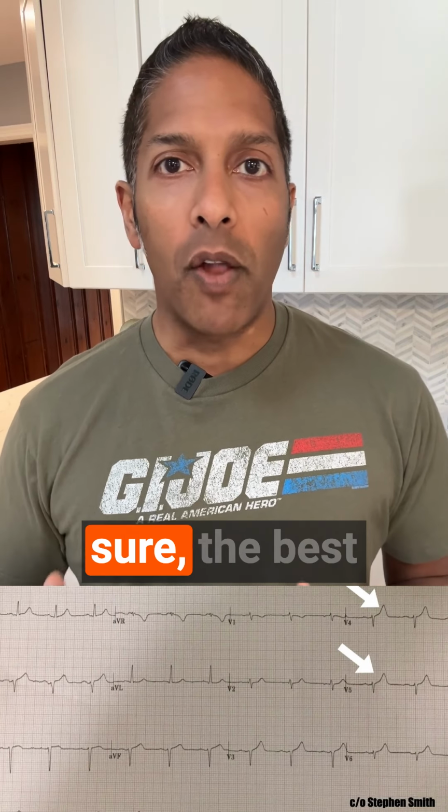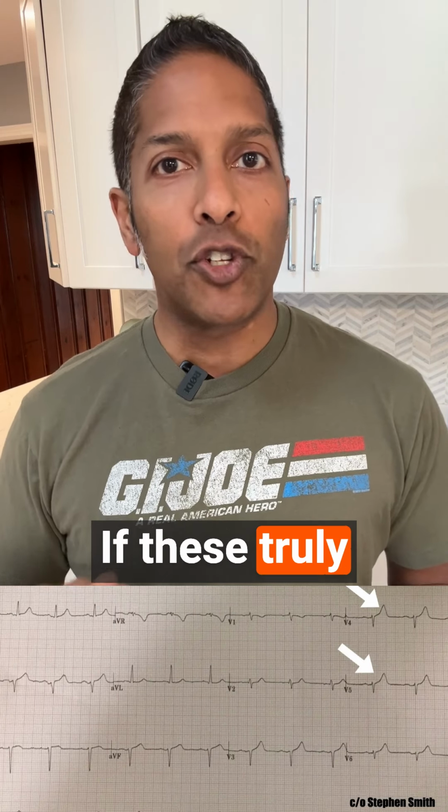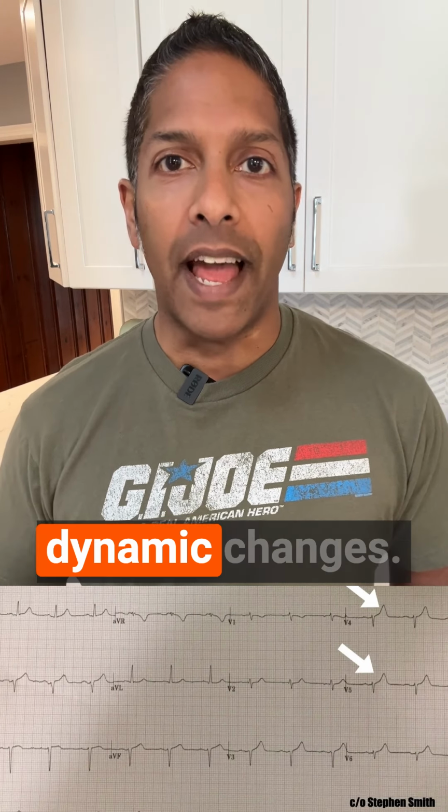If you're not quite sure, the best thing you can do is repeat that ECG in 5 to 10 minutes. If these truly are hyperacute T waves, you're gonna see dynamic changes.